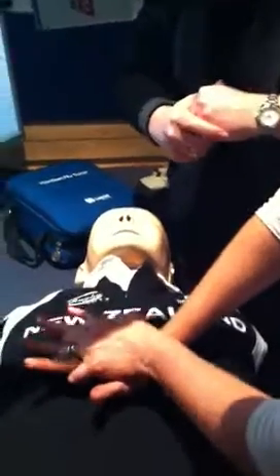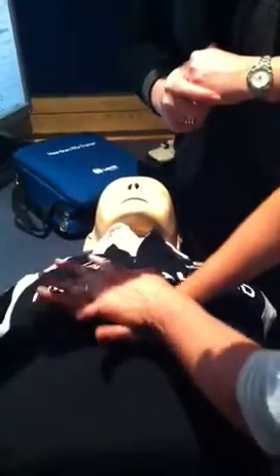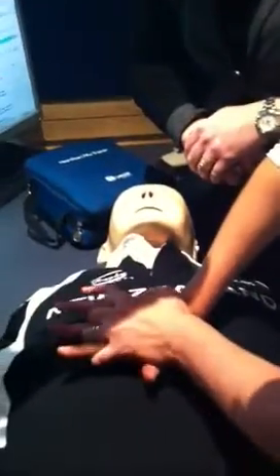Now I have my hands kind of clasped into each other, and the heel of my hand is pushing, and much harder. That's it. Bit of muscle into it, Karen. I'm afraid I'll hurt him or break a rib. Has he got ribs, this mannequin? No. That's it, quite hard, and 30 compressions.